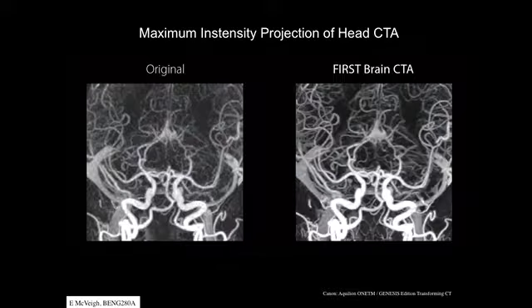Because those of you who are observant would look at this image and say, I could do this just with an X-ray fluoroscope. I inject contrast in somebody's head, put X-rays through their head, and measure the projection. And it would look something like this. However, all of that data would pile up, and you would truly get a projection of all of the pixels through there. If you have three-dimensional data, you can essentially look at what is the brightest pixel on that angle of projection.